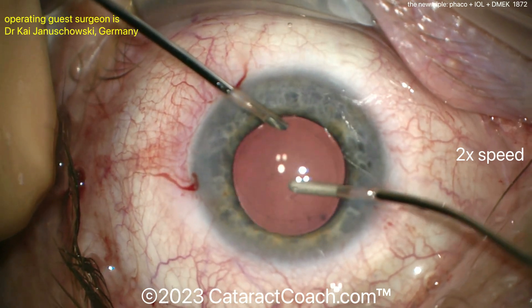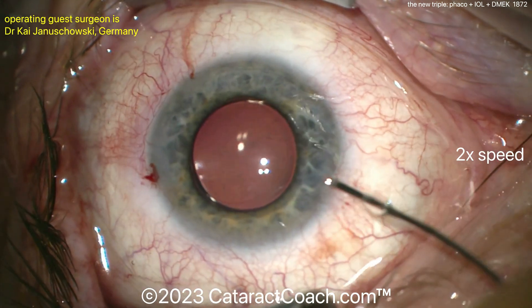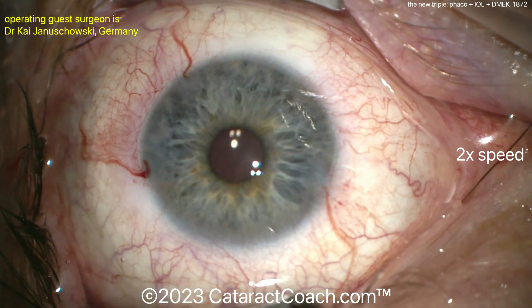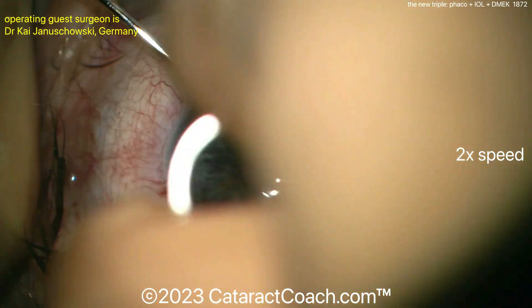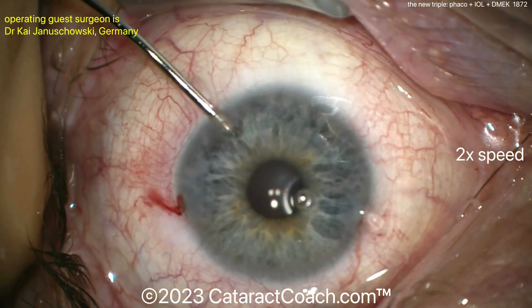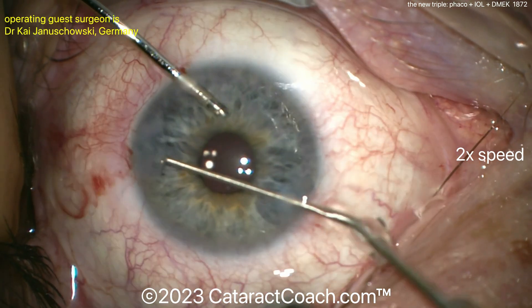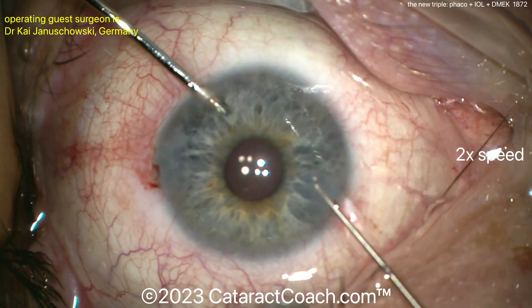There are some great DMEK videos on CataractCoach. I learned DMEK by watching other people's videos and combining them into a nice video on CataractCoach — some amazing videos from really talented surgeons. Here, putting in some miotic to bring the pupil down — that's a nice move. Then a little marking on the cornea to get a guide. What's next is the reverse Sinski hook to score the undersurface and take off the host tissue there — the host endothelium and host Descemet layer.